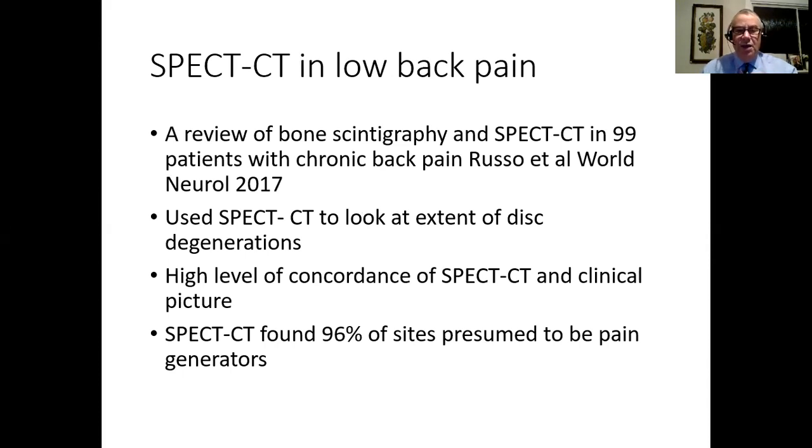And this is something that we see quite frequently, this idea of the pain generator being the site most likely to be the source of pain. And there are several orthopedic surgeons who will do a SPECT-CT, let's say of the spine, and then they will inject steroids in that area because they find that that gives very good symptomatic response.